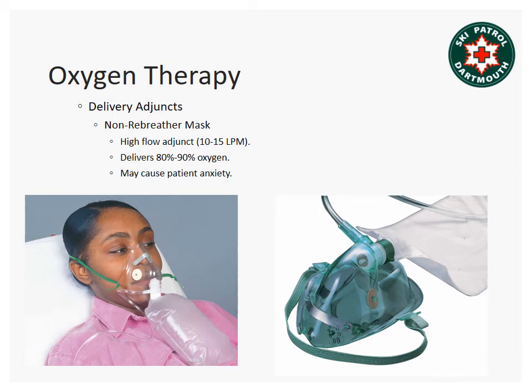Prior to applying this to your patient's face, this valve here should be held closed while the oxygen is flowing, and the bag should inflate to approximately 2/3 full. This bag is a little bit over full.